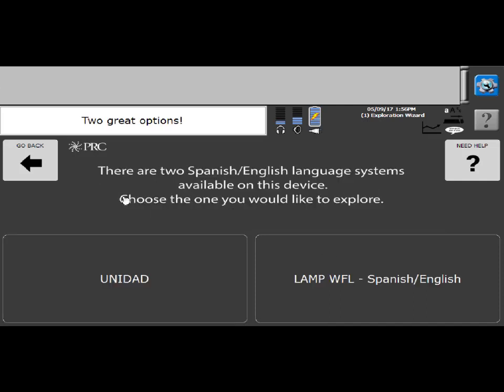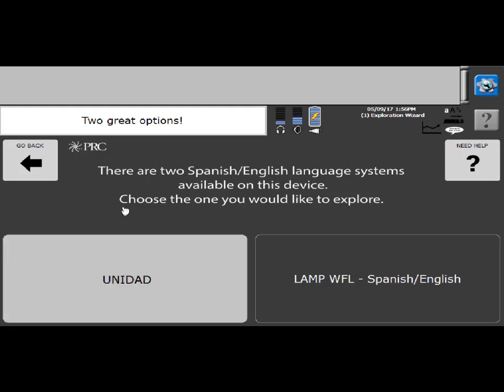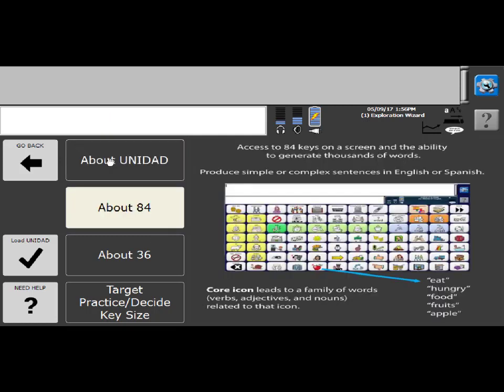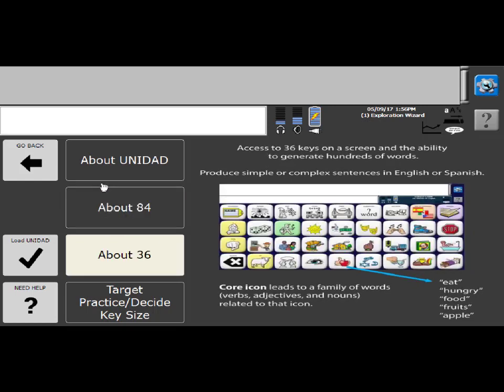So in a UNIDAD configured device, you get access to UNIDAD as well as Lamp Words for Life Spanish English. So in UNIDAD there are two versions. There is an 84 and a 36. Please know that in the 84 there's an English side as well as a Spanish side. And that is the same for 36.